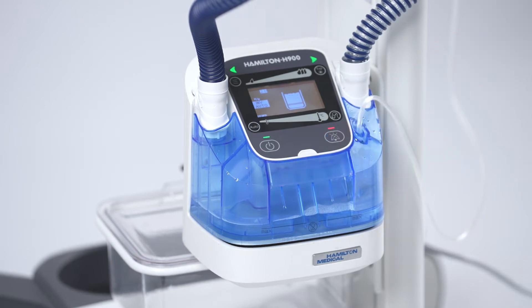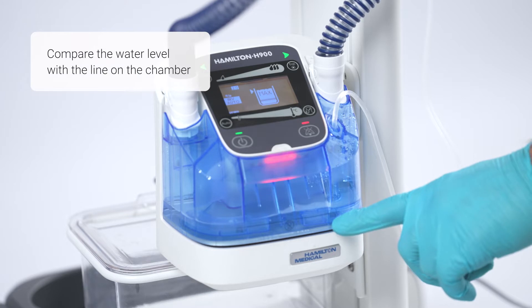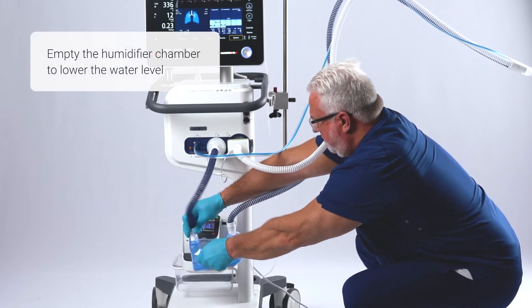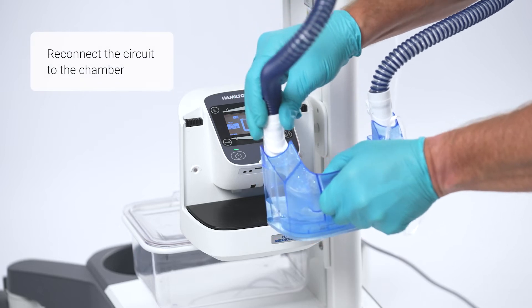There are a few simple actions you can take to avoid or resolve the issue. To start with, check the water level in relation to the line on the chamber. If the water level is above the line, you can firstly empty the humidifier chamber to lower the water level and then reconnect the circuit to the chamber.